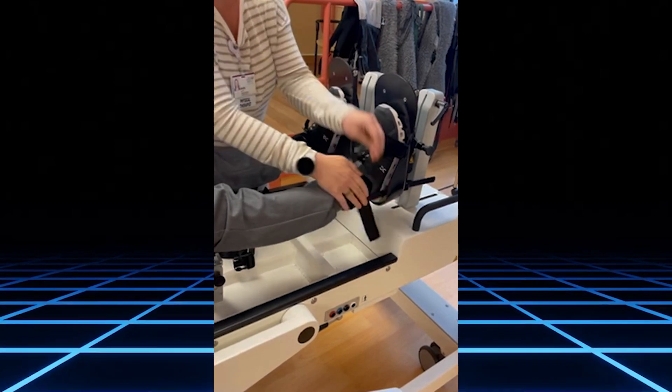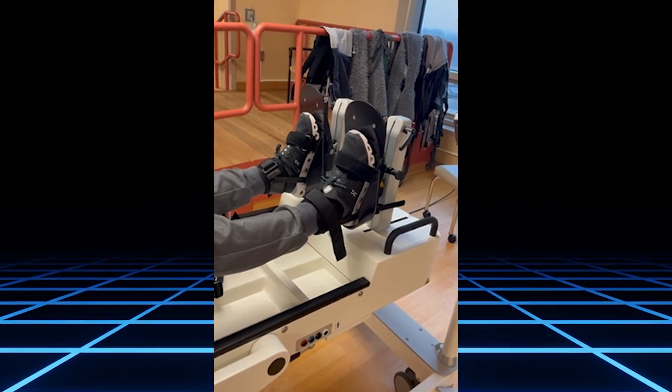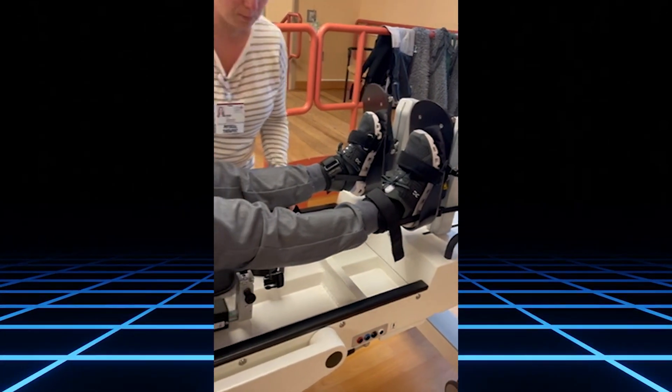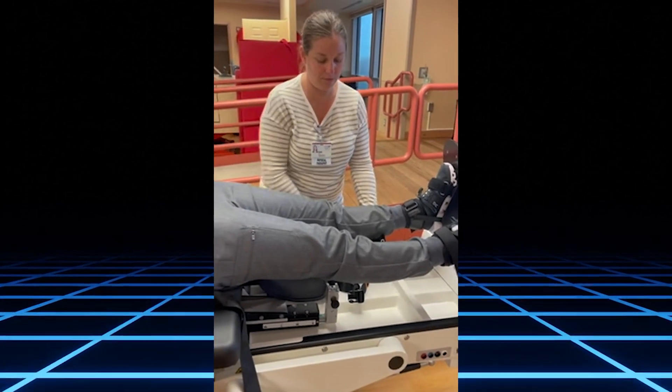There are also pads that can go underneath the foot if the patient was not wearing proper footwear, but she has shoes on so we do not need those pads. For the knee, you want this cuff to be placed appropriately.